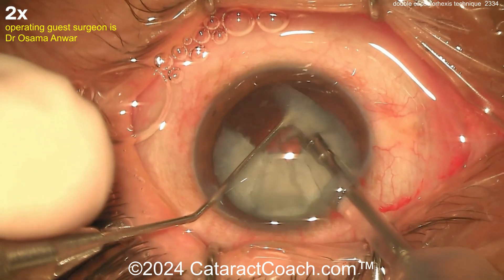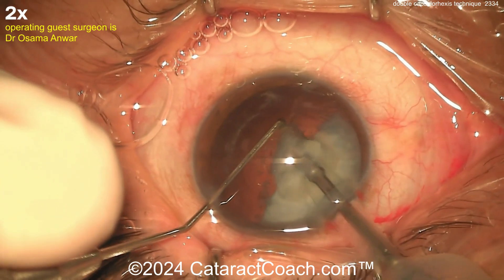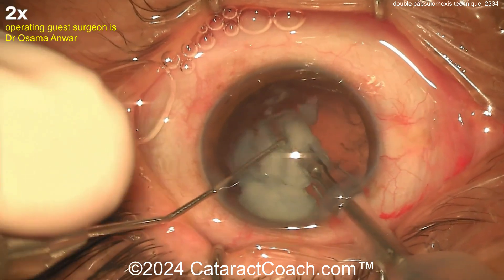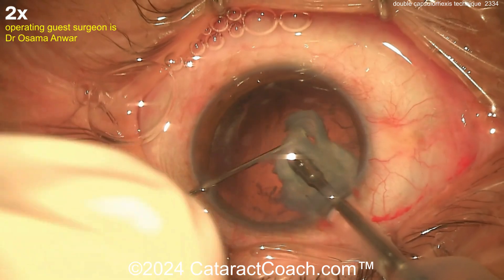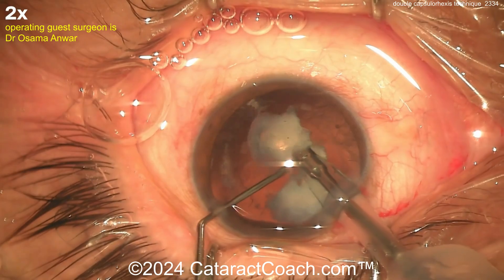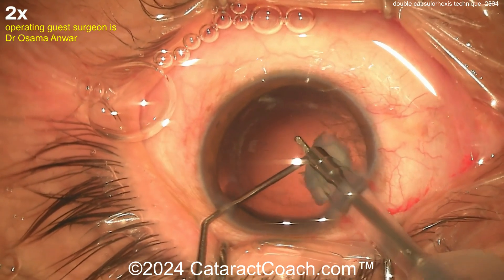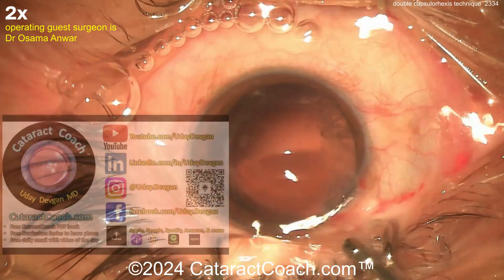It's so easy to just do some nice chop techniques here. Beautiful chopping. These white cataracts, if they're not brunescent at all, chop really easily — you just go into them. Look at that, they fracture so simply, so easy to remove these pieces. Very efficient, beautiful technique here. Look at the chopper now — safety side down. I like that: protect the posterior capsule. There is no lens cortex weighing down the capsule bag, so that chopper is putting the blunt end down towards the capsule just to be sure.